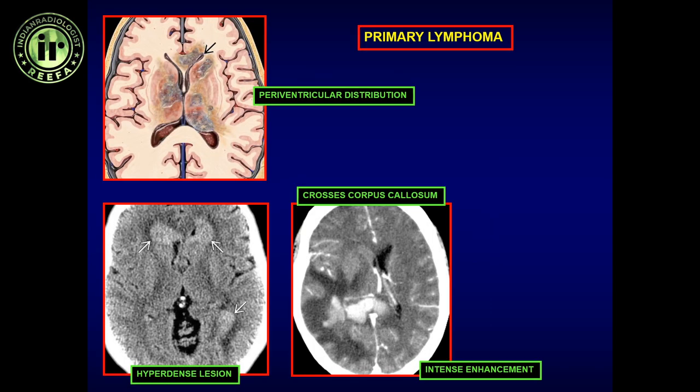Here are a few imaging examples. On non-contrast CT, we see hyperdensity hugging the ventricular lining — when you see a lesion spreading along the ventricular lining, think of lymphoma. The second case is a post-contrast image showing an intensely enhancing mass lesion in the right parietal region, directly crossing over the midline along the posterior corpus callosum.